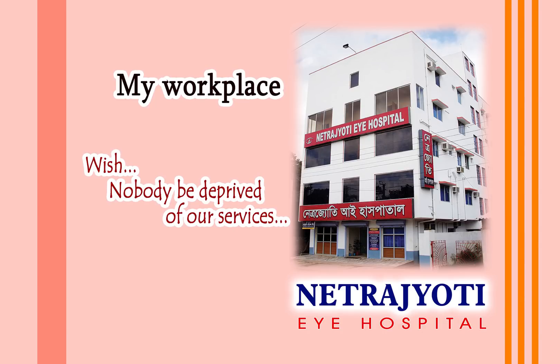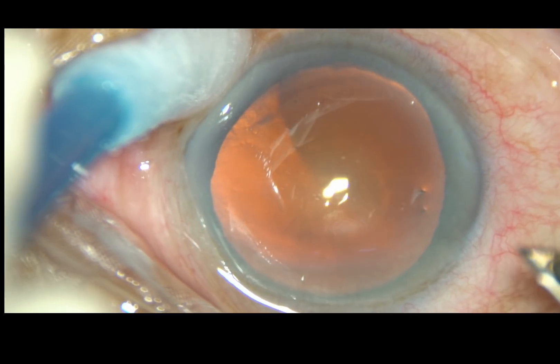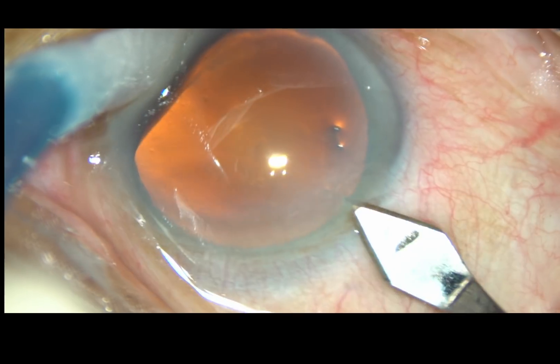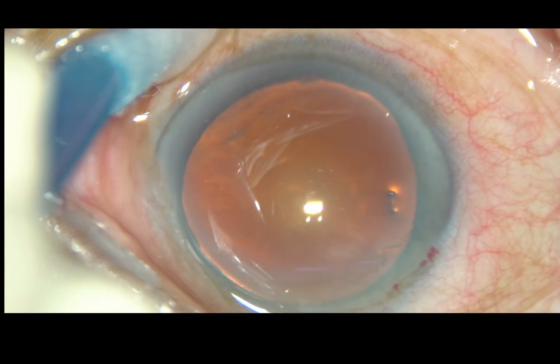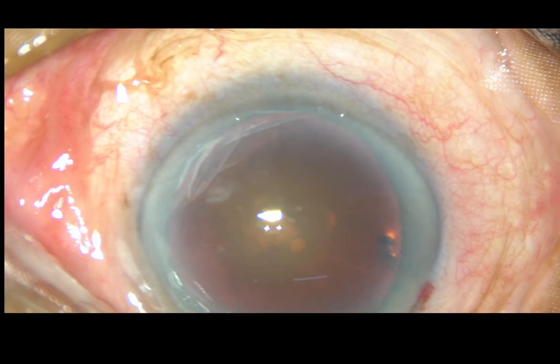Friends, welcome to Netrajyothi Eye Hospital. In this video, I want to show a case where there is anterior insertion of zonular fibers. There is only about 3 mm clear zone. The anterior zonular fibers have come so much anteriorly.